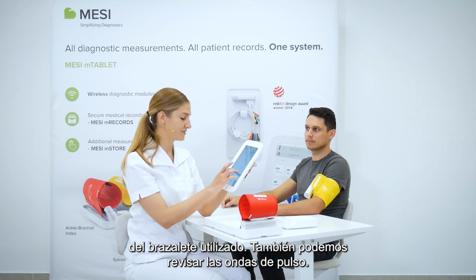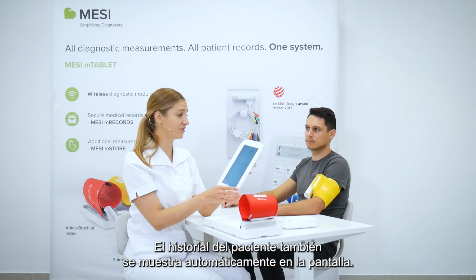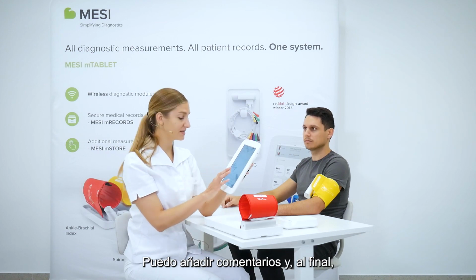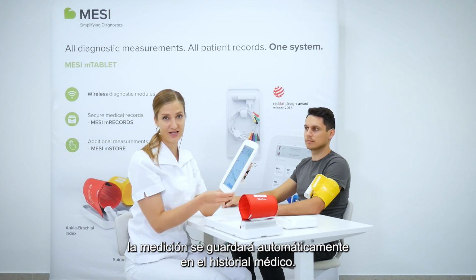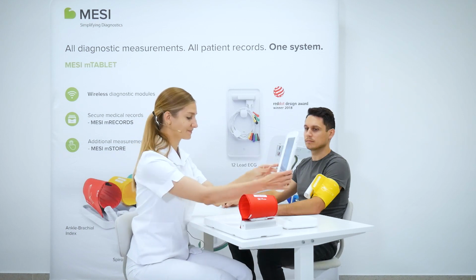review the pulse waveforms. The patient's history is automatically seen on the screen as well. I could add any comments, and when I'm done, this measurement is automatically stored into the patient's healthcare record.